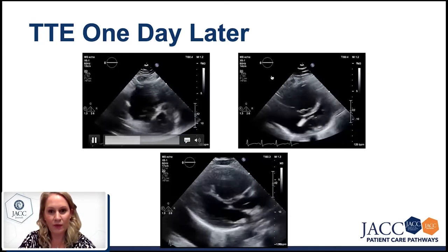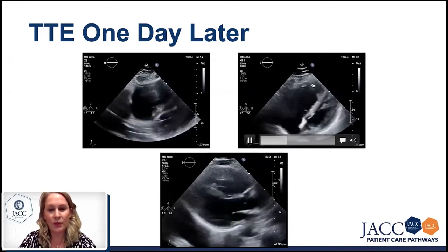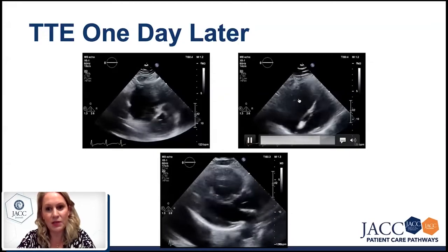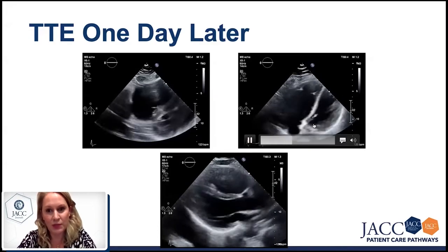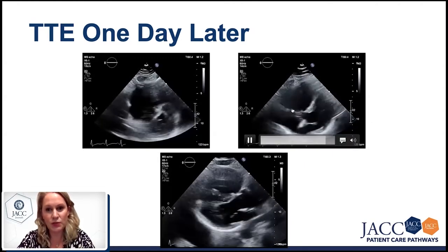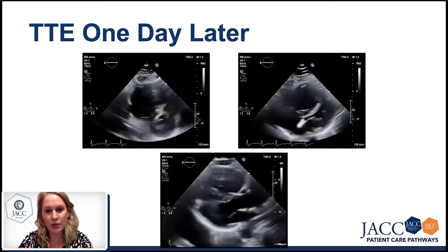On the right, we have the apical four-chamber view, slightly tilted. We can see again that the right ventricle and right atrium are dilated — almost double the size compared to the left heart. The tricuspid annulus is also dilated, so we expect a small degree of tricuspid regurgitation. With the tricuspid regurgitation jet, we can measure the right ventricular systolic pressure.